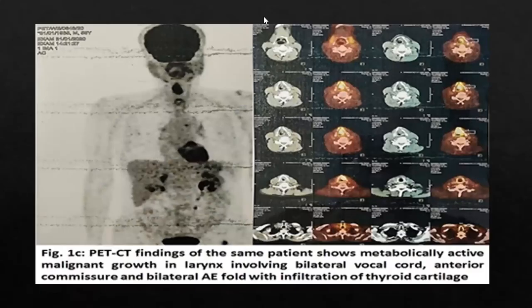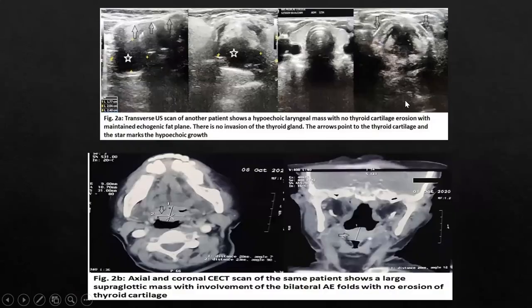Similarly, the PET-CT is showing the involvement of bilateral vocal cord and anterior commissure with thyroid cartilage invasion. The second image shows a mass, but the thyroid cartilage is intact — there is no invasion of the thyroid cartilage. The coronal CT section also shows the mass with no involvement of the thyroid cartilage.